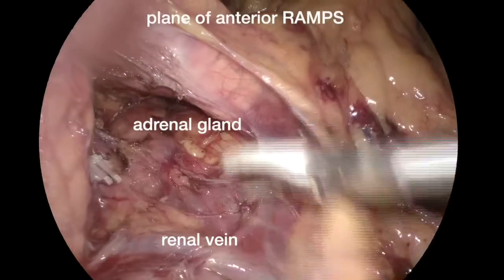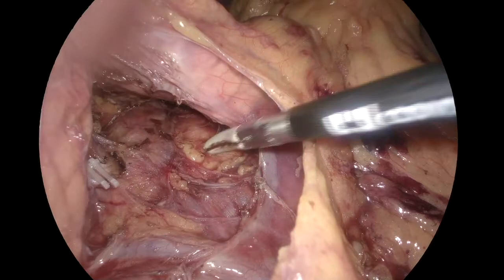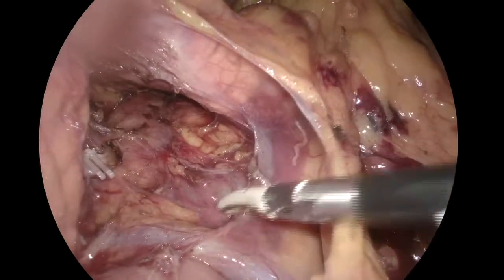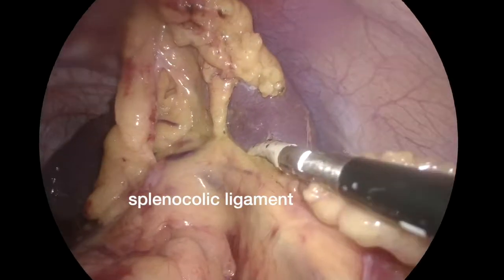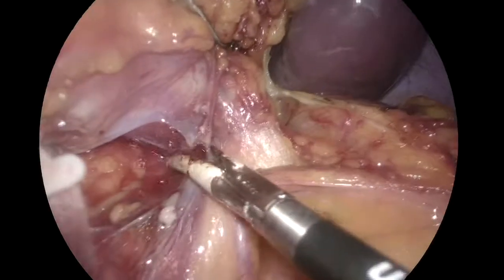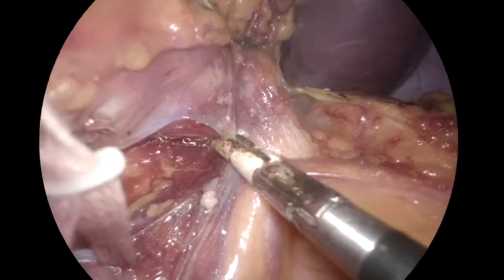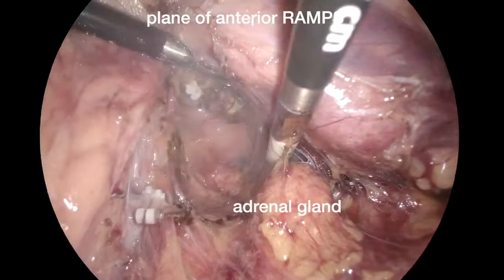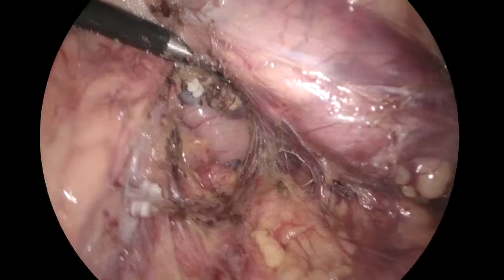Now we could locate the adrenal gland and the renal vein below, so we just keep dissecting above these two structures until we got around the spleen at the end. The spleen was detached from the splenic flexure. Be careful not to get too close to the lesions. Just keep dissecting anterior to the adrenal gland, to the left of the patient.